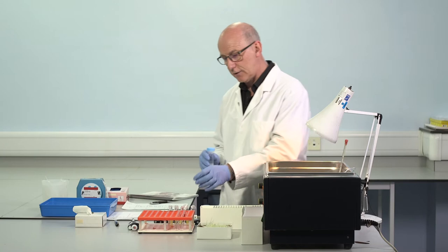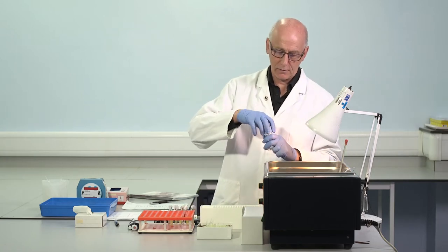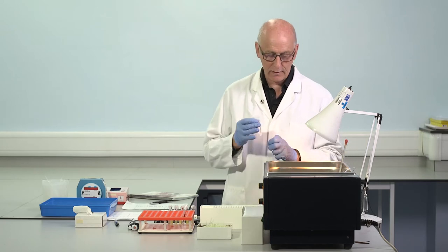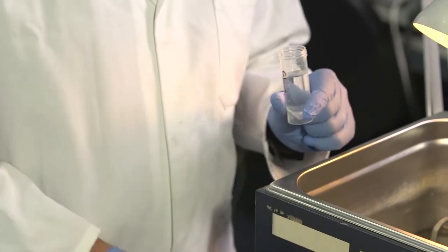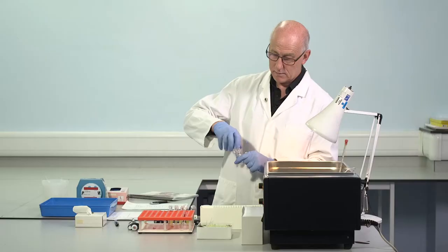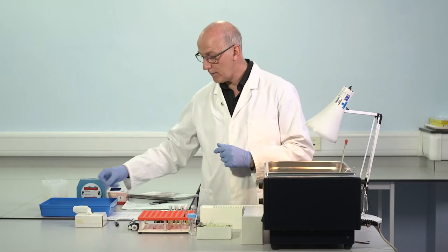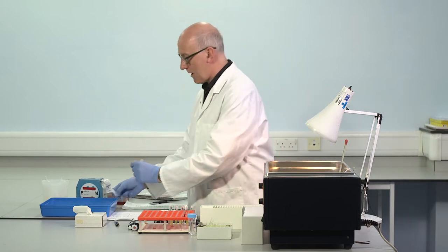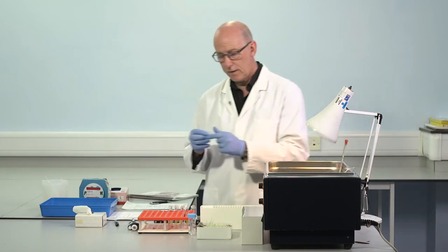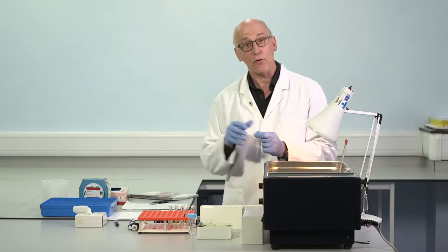So again, I need to make sure that we have a solution of calcium chloride, also at operating temperature 37. So this will also go in the water bath now to be coming up to temperature. If this were an auto-analyzer, same issue. We'd want the reagents to be on board the analyzer for sufficient time in order that they would reach the operating temperature on the platform of the analyzer.